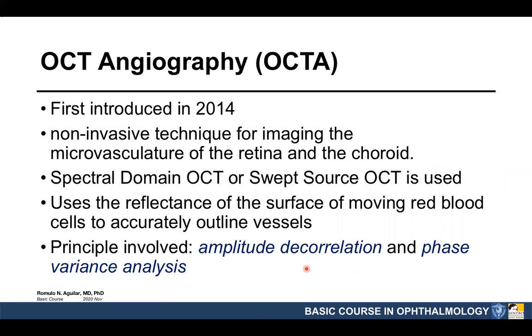Now, just briefly, we'll discuss OCT angiography. Strictly speaking, it's not a means to visualize the ocular fundus. But since it uses the OCT technology, mainly spectral domain and swept source, I'll just discuss it in passing. It's actually more related to fluorescein angiography, and I think you will have a separate lecture on that. Your lecturer might touch also again on OCT angiography in that lecture.